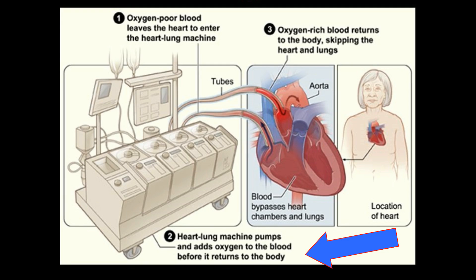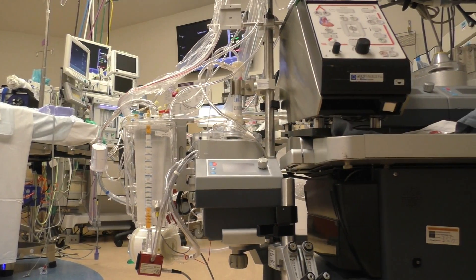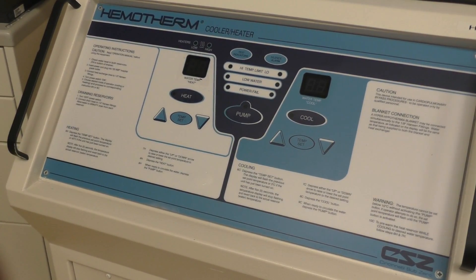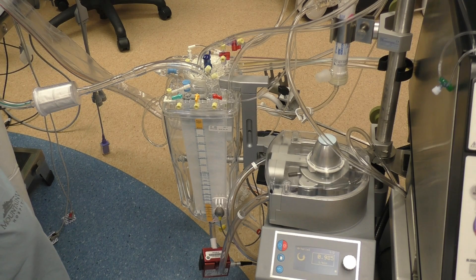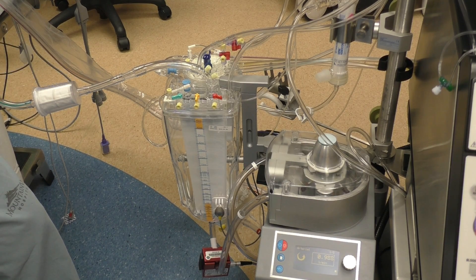Once it's oxygenated, it rides up through this tubing and goes back into the patient. Another cool feature is that we're able to cool or heat the patient through the oxygenator. We simply hook it up to what we call a heater-cooler that runs hot or cold water through it, and there's a transfer of energy that allows us to cool the patient down. Cooling the patient slows your metabolism down, and we're doing very invasive work on the heart. The better we can protect the rest of the body — the organs, the brain — the more successful the surgery is going to be.